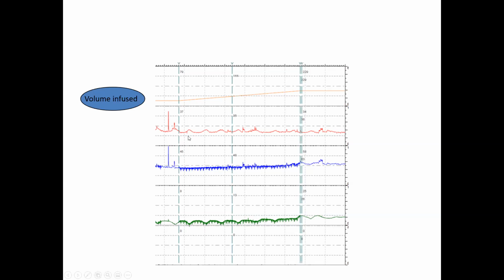These are coming from the abdominal line. They're slightly more evident if you haven't put the rectal catheter in far enough, and it's sat within the muscular structure of the anal canal. If you can pass it into the rectum, they're slightly less evident, and they don't happen in everyone. There's nothing I necessarily need you to do about them, apart from please never overanalyze this as being any form of detrusor overactivity. Make sure that if you've got any concerns, you look at the lines above.